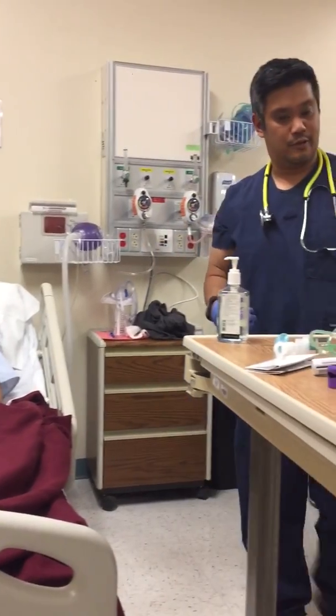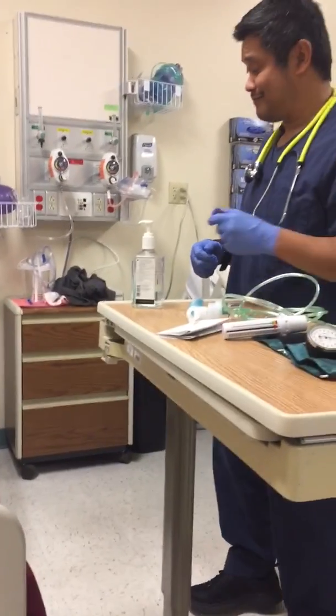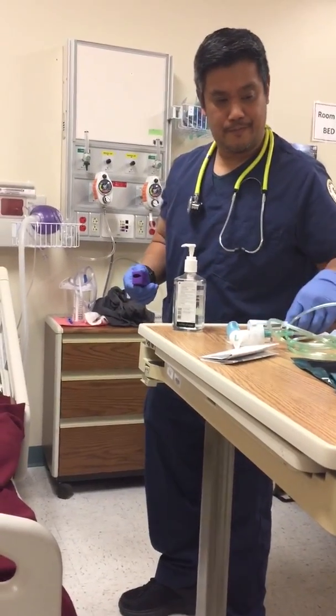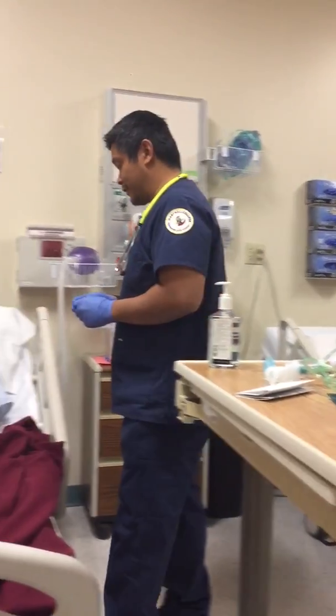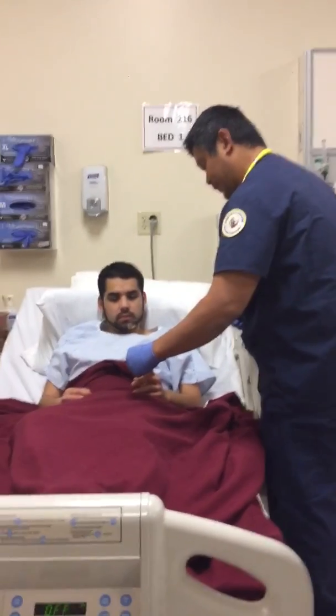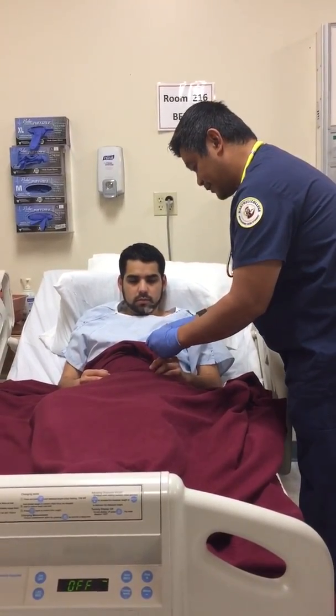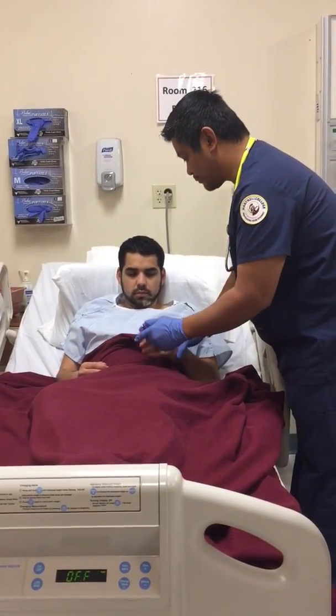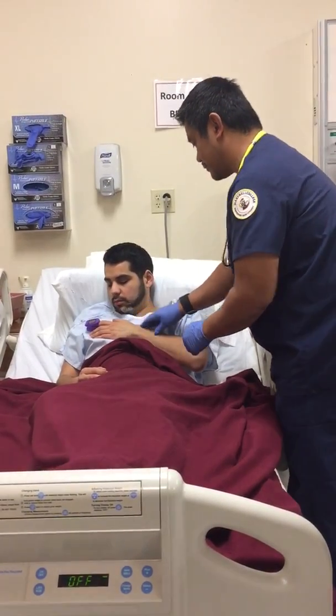All right, so we're going to check your oxygen saturation, and also going to check your heart rate. Okay, just put this on your finger here. If you don't mind, just put your hands across your chest right here. Thank you so much.